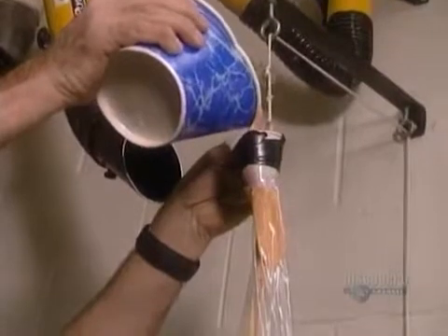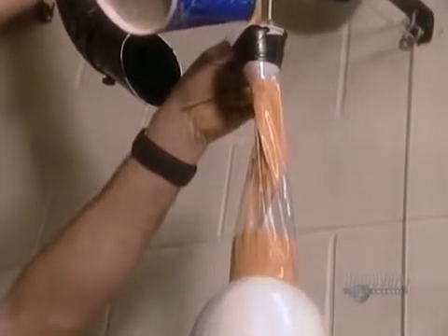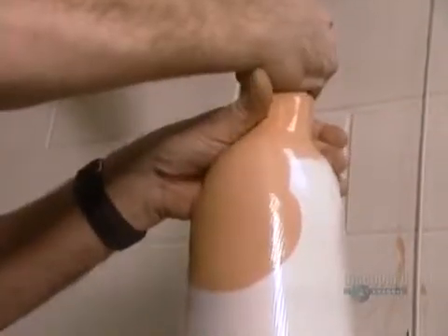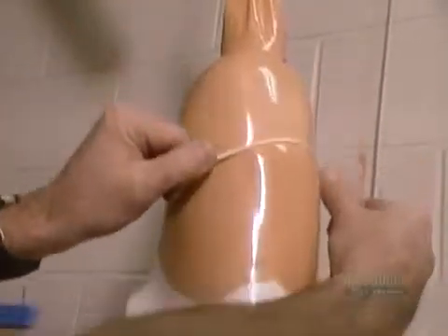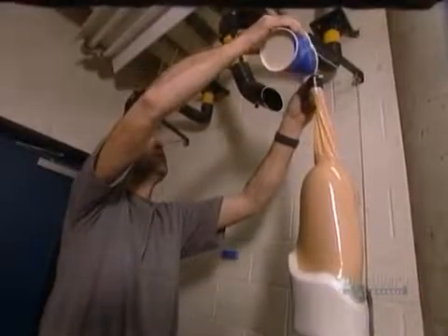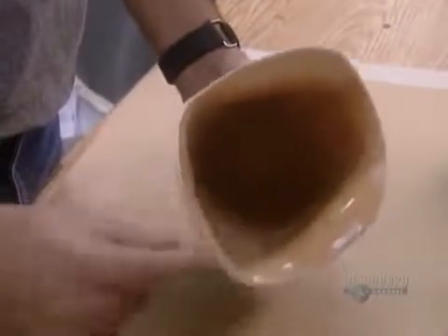Then they coat the socks with a liquid resin made of either polyester or acrylic. Here, they're using acrylic tinted to look like Caucasian skin. It's important to ensure the surface is evenly soaked — a meticulous process that takes about an hour. The acrylic solidifies in about an hour; polyester takes about 12 hours. They then break the plaster mold inside, leaving a durable plastic shell called a socket. That will be the basis of the artificial limb.